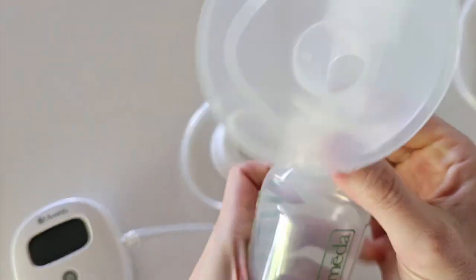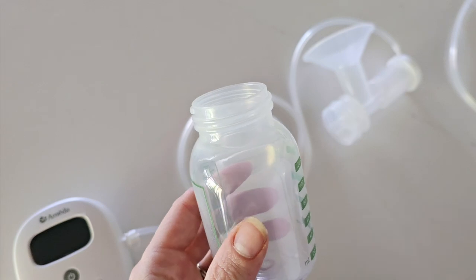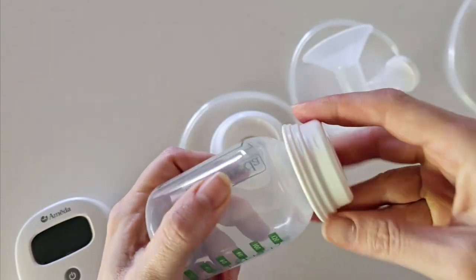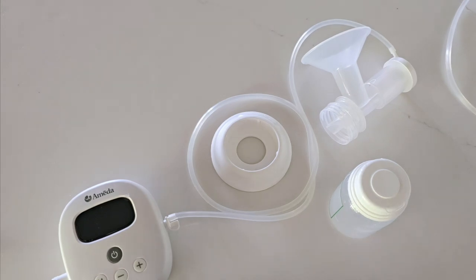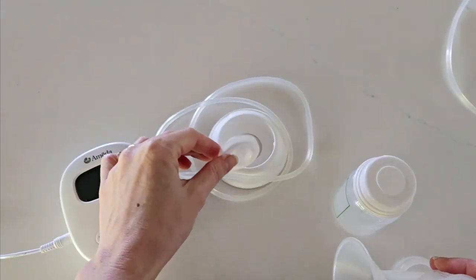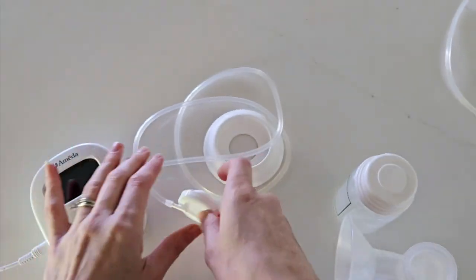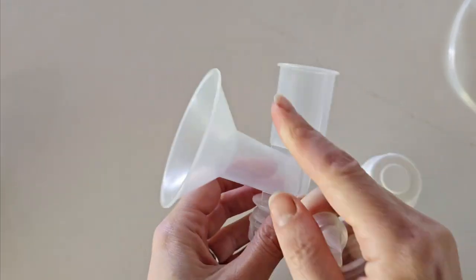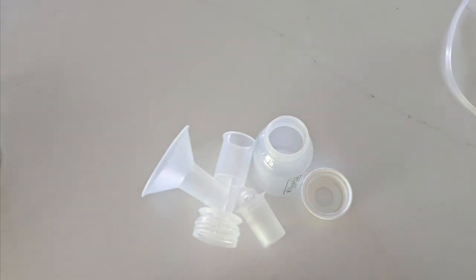Once you've removed your pump, unscrew your bottle. If you're using the milk straight away, place your nipple on; or use the little cap and store it. For cleaning, the parts that need to be washed are those that come in contact with breast milk: your diaphragm, duckbill valve, flange and any inserts, and your bottle and bottle cap. The adapter cap, tubing, and pump motor do not come in contact with breast milk and do not need to be washed or sterilized.